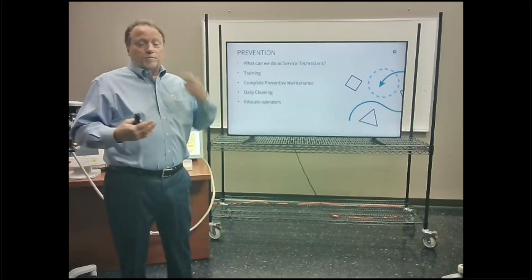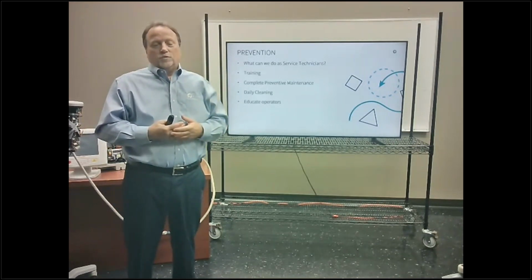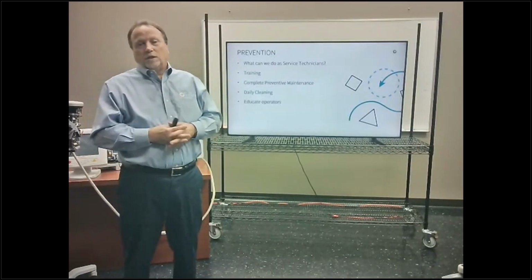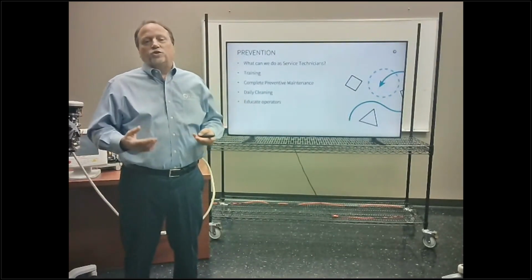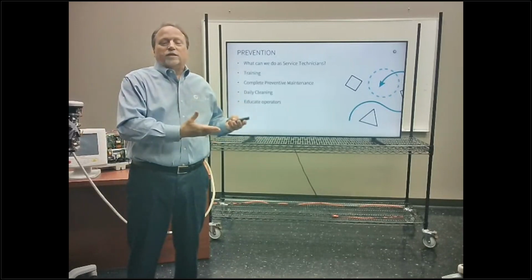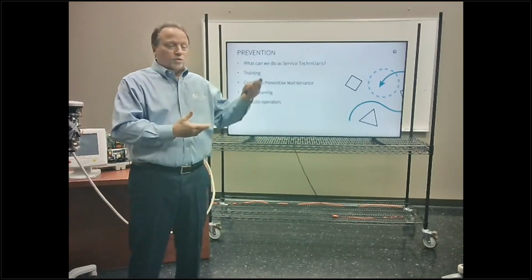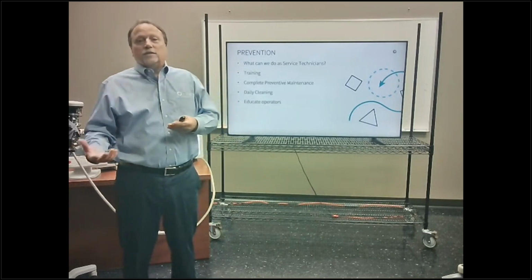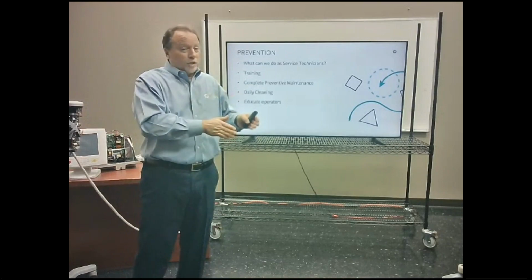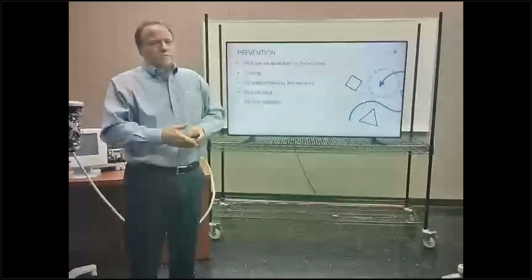Wipe it down. Take the pressure jacket off. Clean the pressure jacket. If they have a spill, clean it up. There's no reason why you should be walking on the floor and your feet sticking to the contrast on the floor. Okay? Train your techs, talk to your techs that keeping a clean machine will drastically decrease the downtime of that injector. Along with your preventive maintenance and daily, weekly, monthly cleaning, it is actually in their operator's guide to do this. And you can point that right out to them in a nice way.